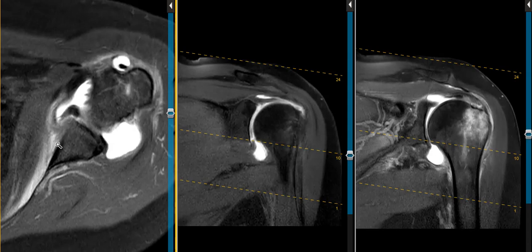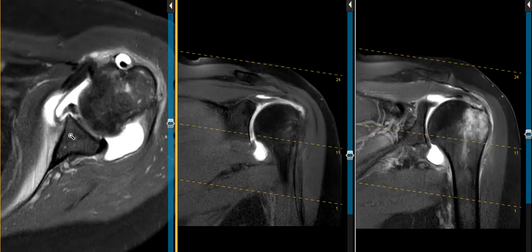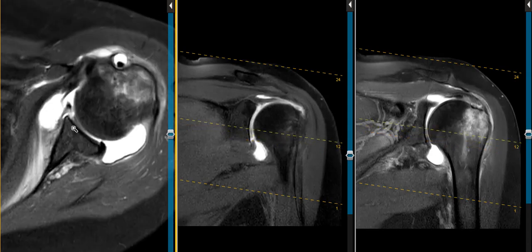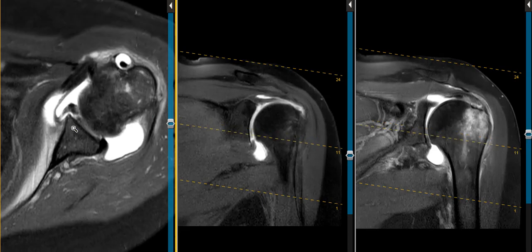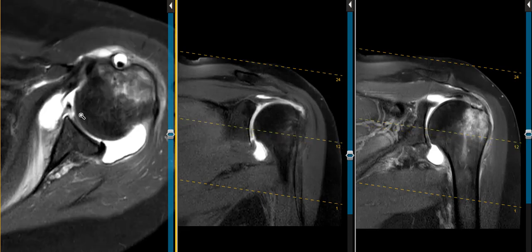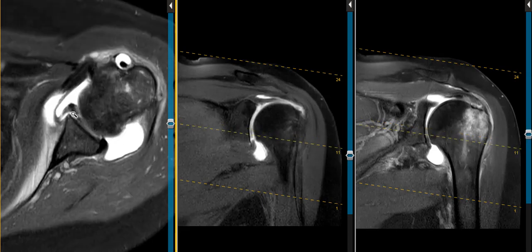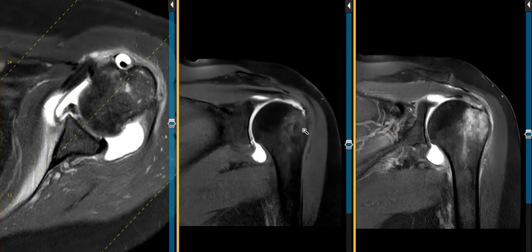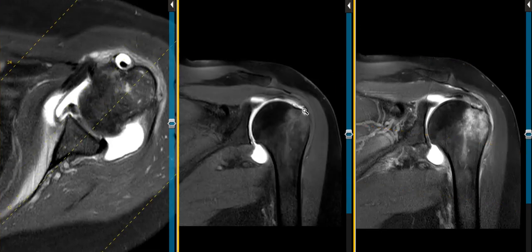The capsule is partially stripped from the anterior scapula here. This is a very significant tear, and the surgeons are going to have to go in there and try to tack that back down and repair this rotator cuff.